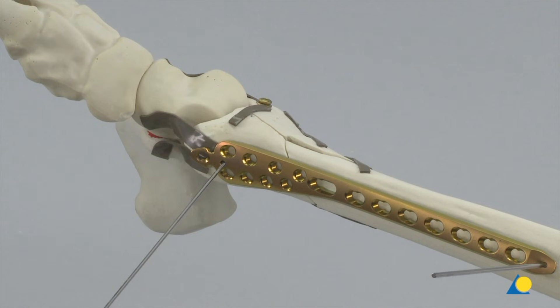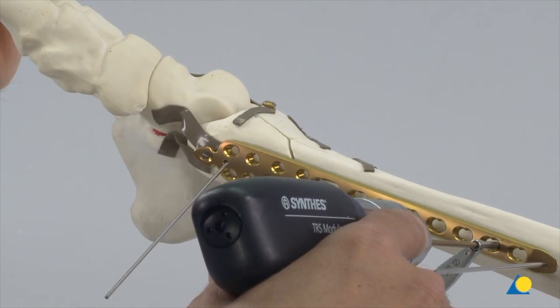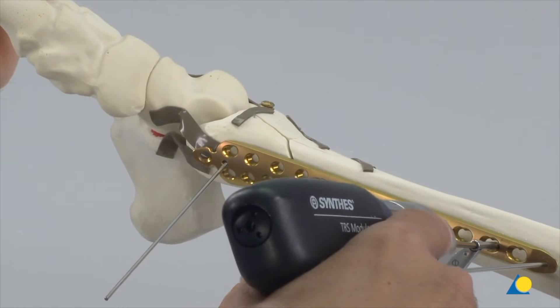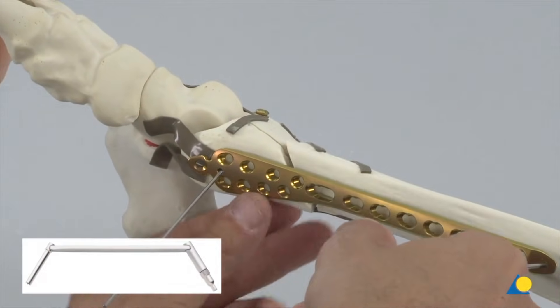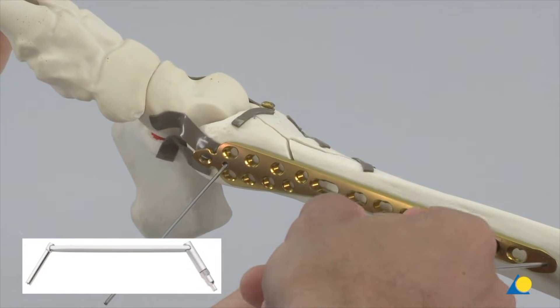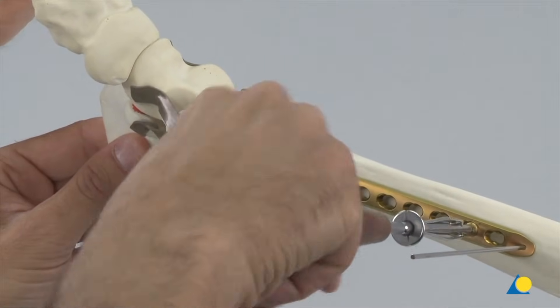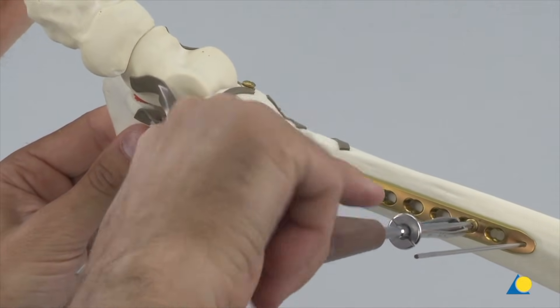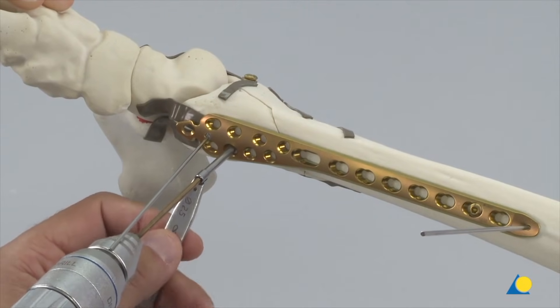To achieve proper alignment, the LCP is fixed with cortex screws proximally and distally. The 2.5 mm end of the double drill guide and a 2.5 mm diameter drill bit are used to drill a hole, which is measured with the depth gauge. The universal drill guide 3.5 can also be used to centralize the drill bit into the plate hole. A cortex screw is inserted first proximally with the small hexagonal screwdriver, then the procedure is repeated at the distal end.